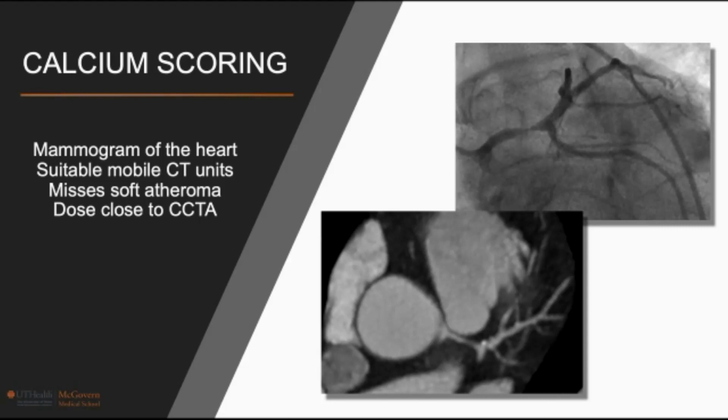Within a few thousand cases, I have seen a handful of cases like this one I'm showing you here. This patient had typical angina when exerting himself, playing golf or tennis, had a couple of SPECT studies which were inconclusive, and finally was sent for coronary CT angiogram that showed just a punctate calcified atheroma. Calcium scoring would have been very, very low. However, this lesion in the left main was very concerning. The patient was sent to cardiac catheterization, which confirmed the soft atheroma, nearly occluding the left main. The patient was treated based on this, and his life was saved, I would say.